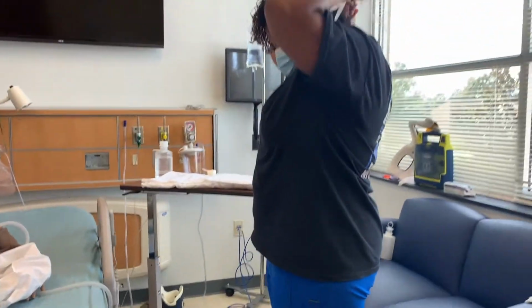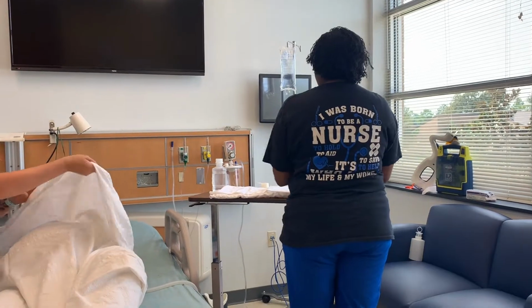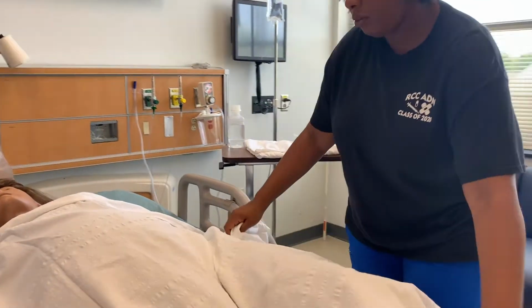If you suspect that the chest tube has become dislodged, it may be necessary to consult a physician, and a chest x-ray may be ordered to verify placement.